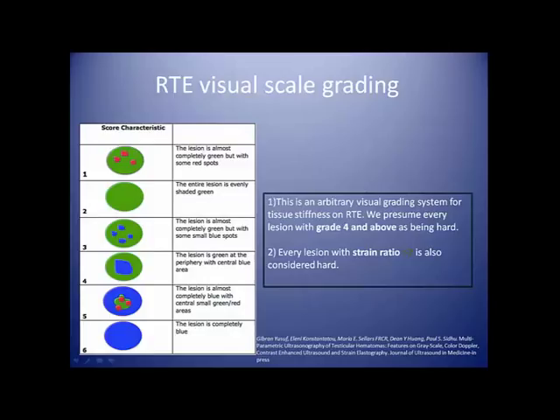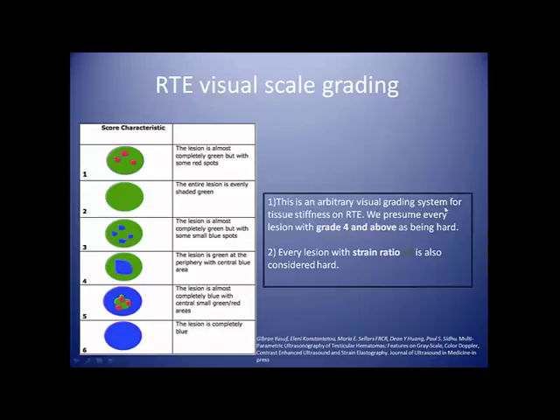RTE visual scale grading: scores from 1 to 6. Score 1 is green with red areas; almost completely green with some red spots — a soft lesion. A green lesion is also soft, then we start to see some blue spots, a more confluent blue area, a predominantly blue lesion with some soft appearances, and then a completely blue lesion. This is an arbitrary visual grading system for tissue stiffness on real-time elastography.